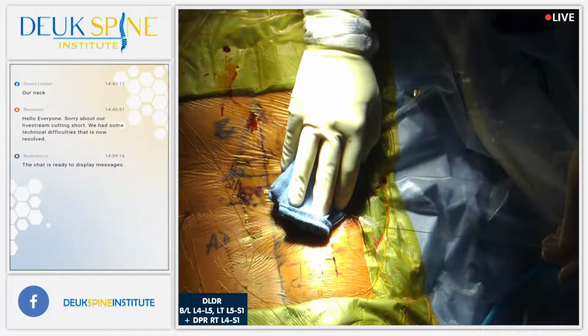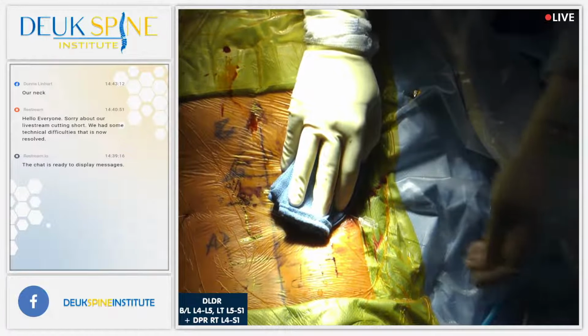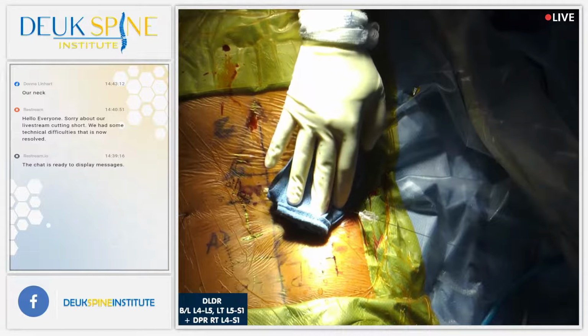Let's run our video showing the audience how does the Deuk laser disc repair work.